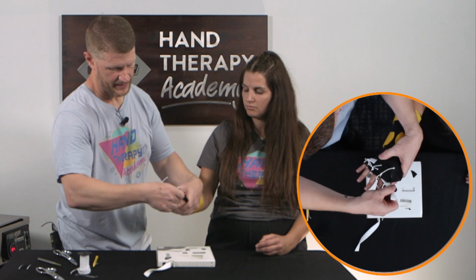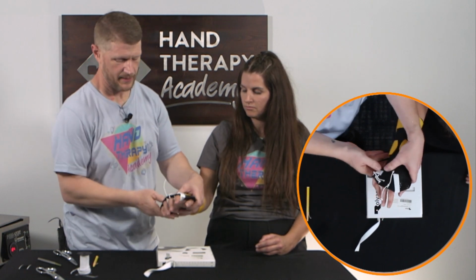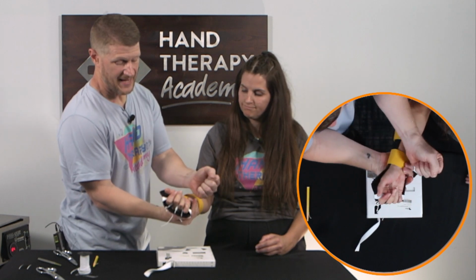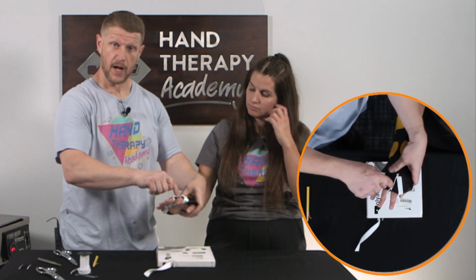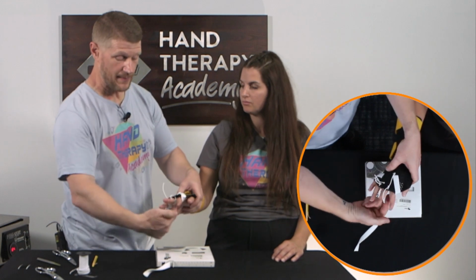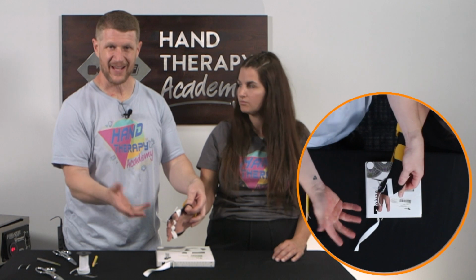Okay, I get those flat. And then when I get to the index, I bring that around and it comes up across the back side. So now they have the ability, I'm going to turn over here, to bring those fingers down. And if that's too much resistance, I loosen the knots here and give them more slack there, or I loosen the tension on this strap that's looping through. Okay? I've got too much back here, trim that down as you see fit.